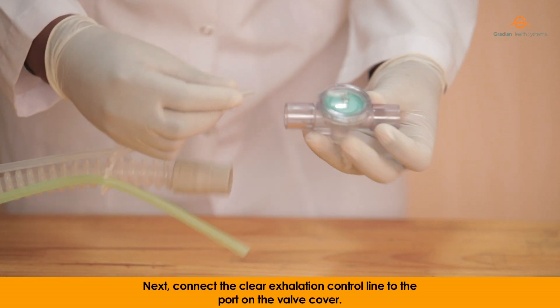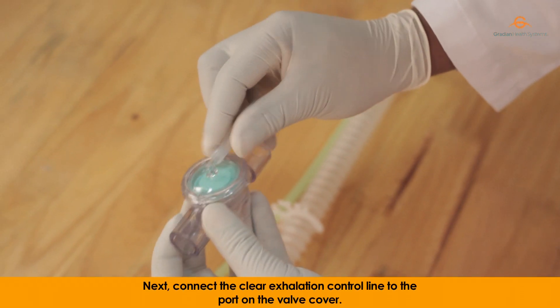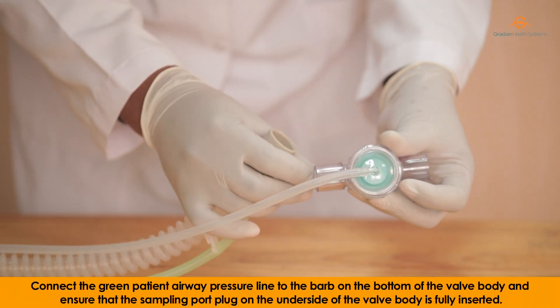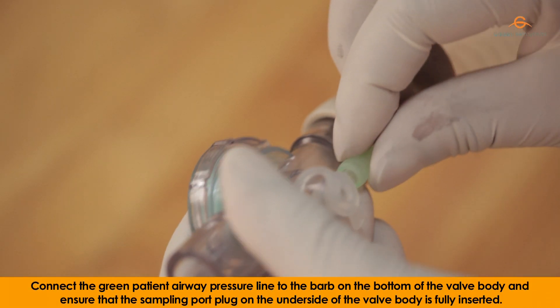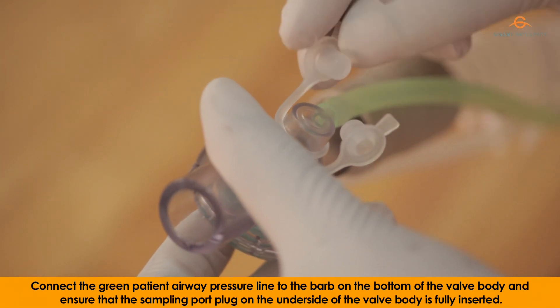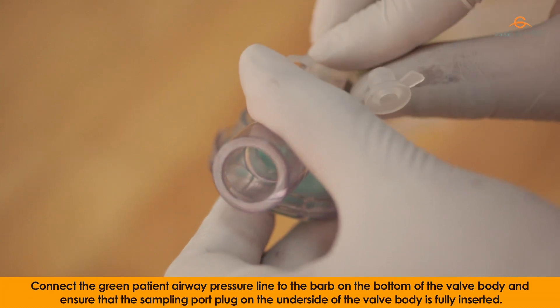Next, connect the clear exhalation control line to the port on the valve cover. Connect the green patient airway pressure line to the barb on the bottom of the valve body, and ensure that the sampling port plug on the underside of the valve body is fully inserted.